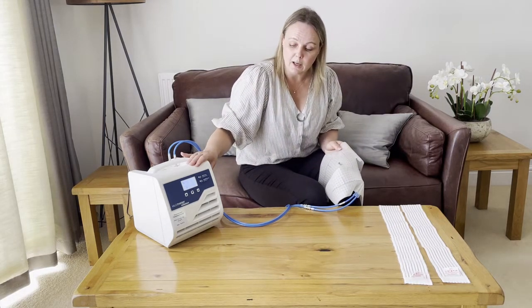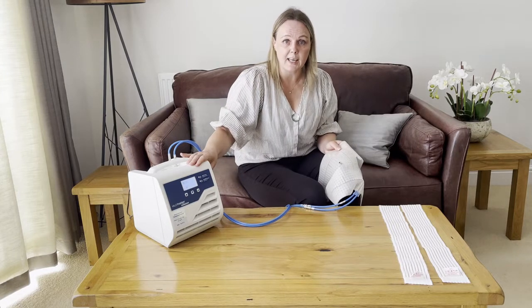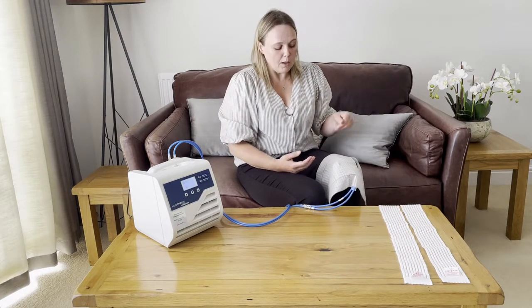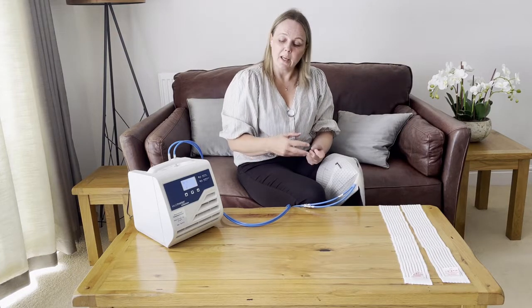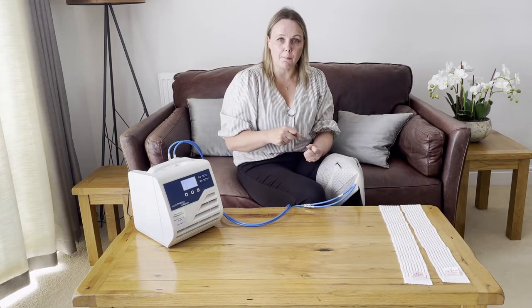The recommended temperature for the knee cuff is between 15 and 18 degrees, with 15 being the colder of those temperatures. You may want to go slightly lower if you are trying to permeate through bandaging or clothing, and you could take this down as low as 12 degrees.